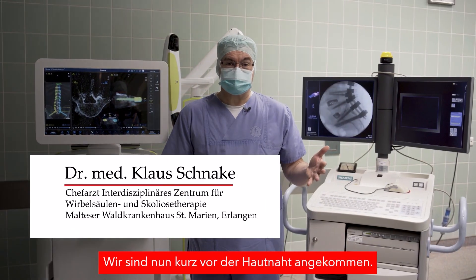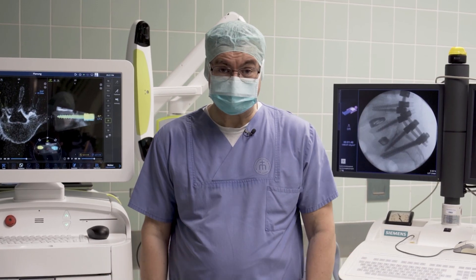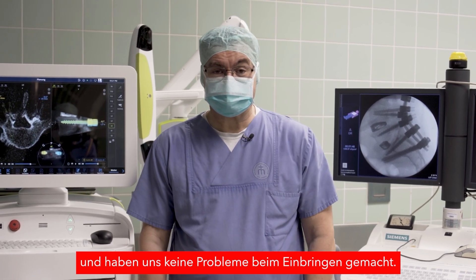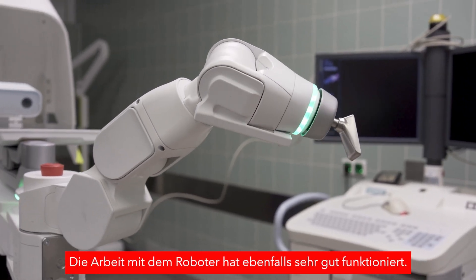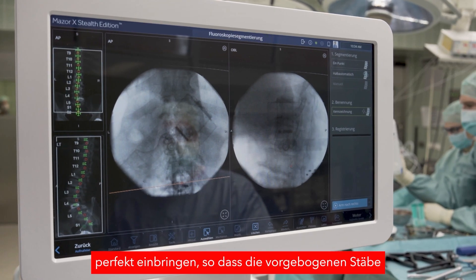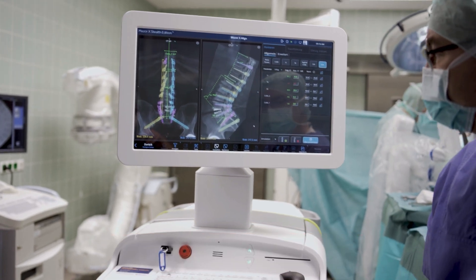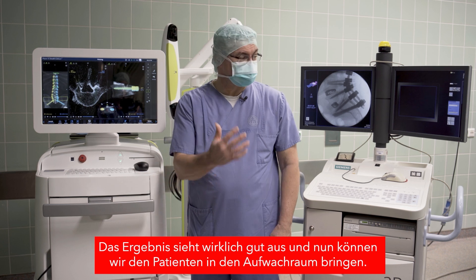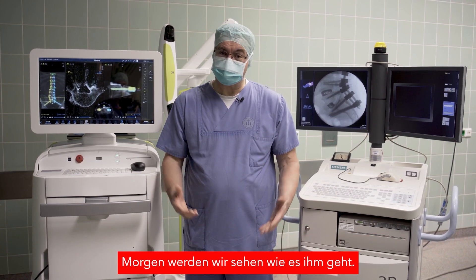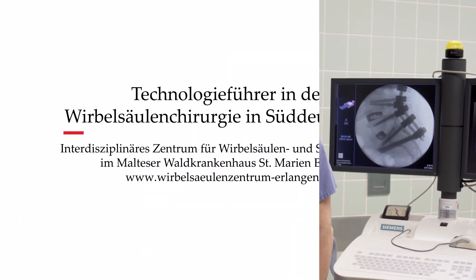We are about to close the skin now. The unit rods fitted perfectly — no worry, no hassle to place them. The work with the robot went well as well; with the Masore we could place all the screws in the perfect position so that the pre-bent rod fitted as we had planned it. We are quite happy, it looks really good, and now we will send the patient to the recovery room. We'll see how he is doing tomorrow. Thank you very much and take care.